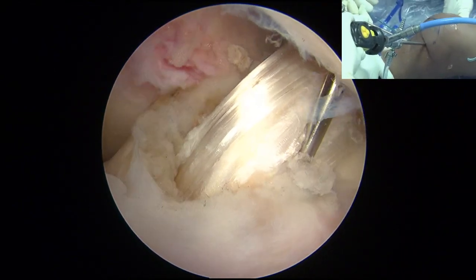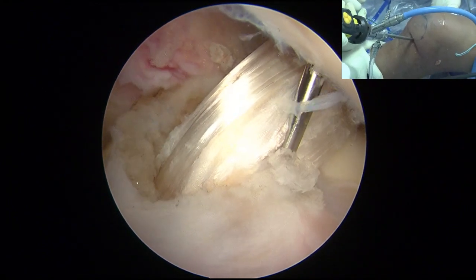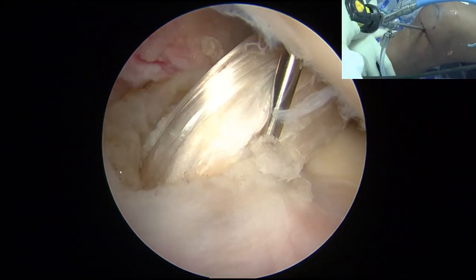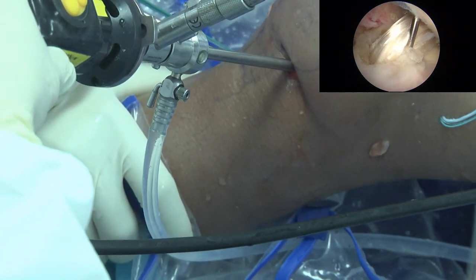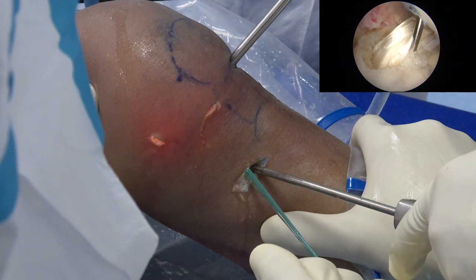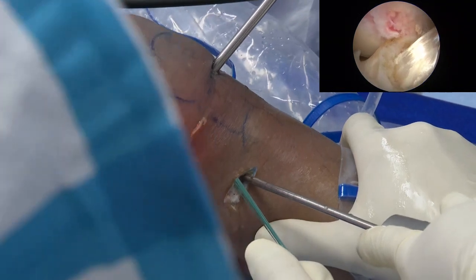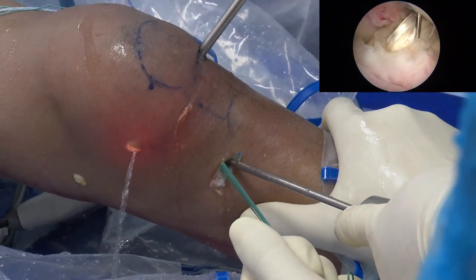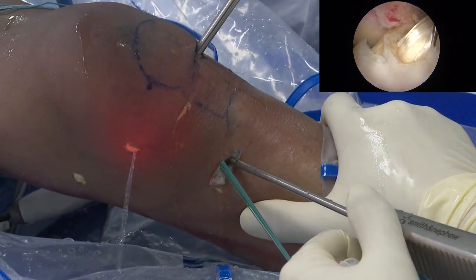Okay, good. Yeah, very good. Very good feeling. Okay. Okay, bone soft. The bone is soft. It's good enough. Okay, I'll put my left hand on there. Okay, good. Mallet, please. 锤子. For this. Good. So when you turn the screw in, I will knock down a little bit.